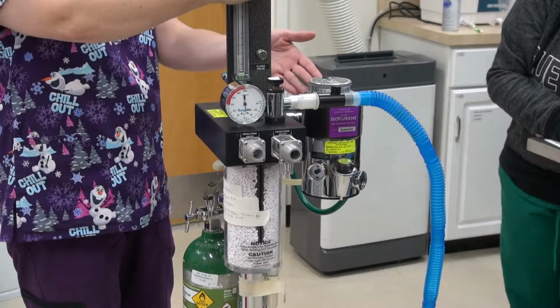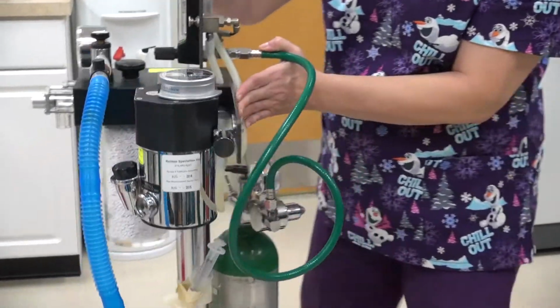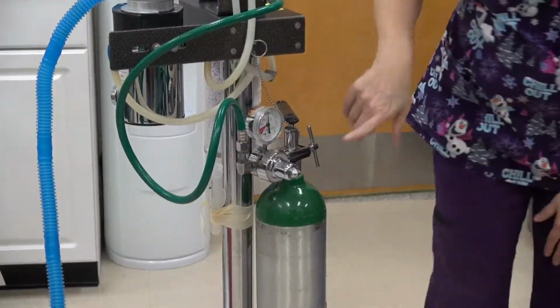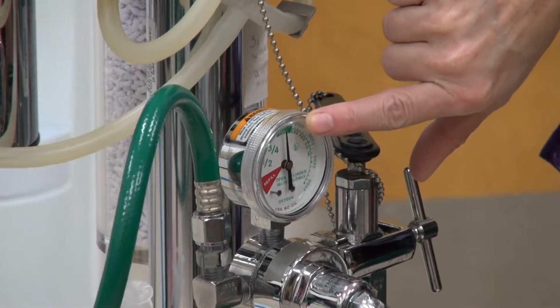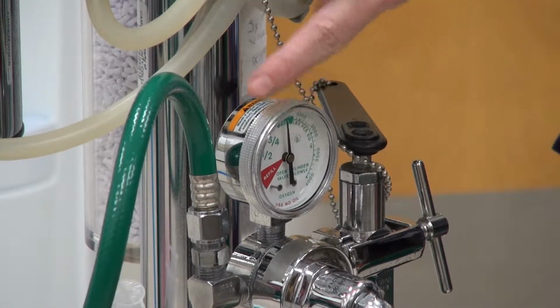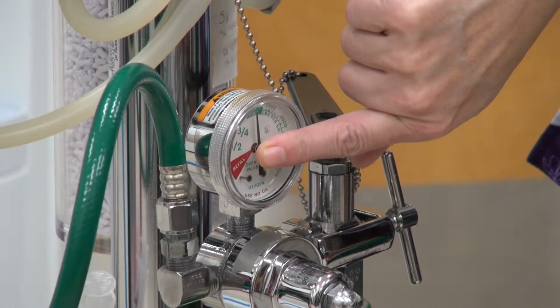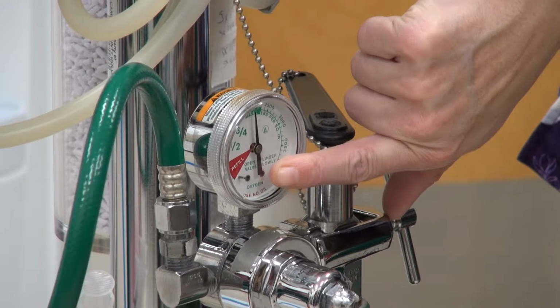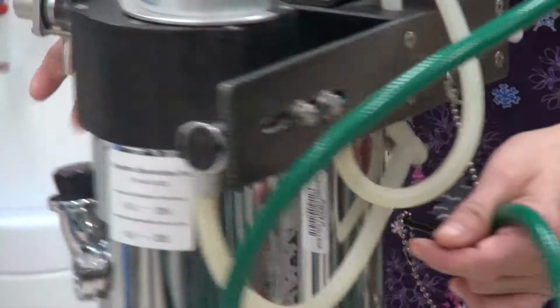All right, so we're checking the oxygen on our tank. This is a great gauge because look, see the difference here? This tank is telling us right now that we are at the full level. And actually we'll read down to 3/4, 1/2, and then it'll tell you refill in the zone of 500 or less, okay? So that's great.